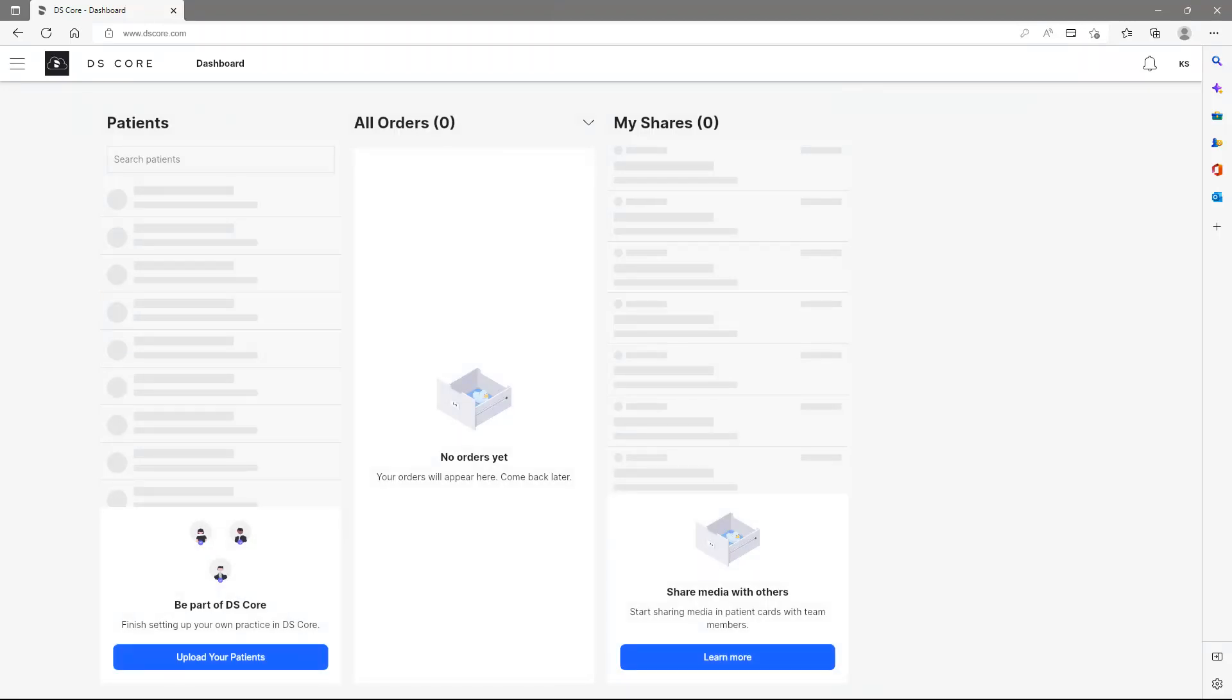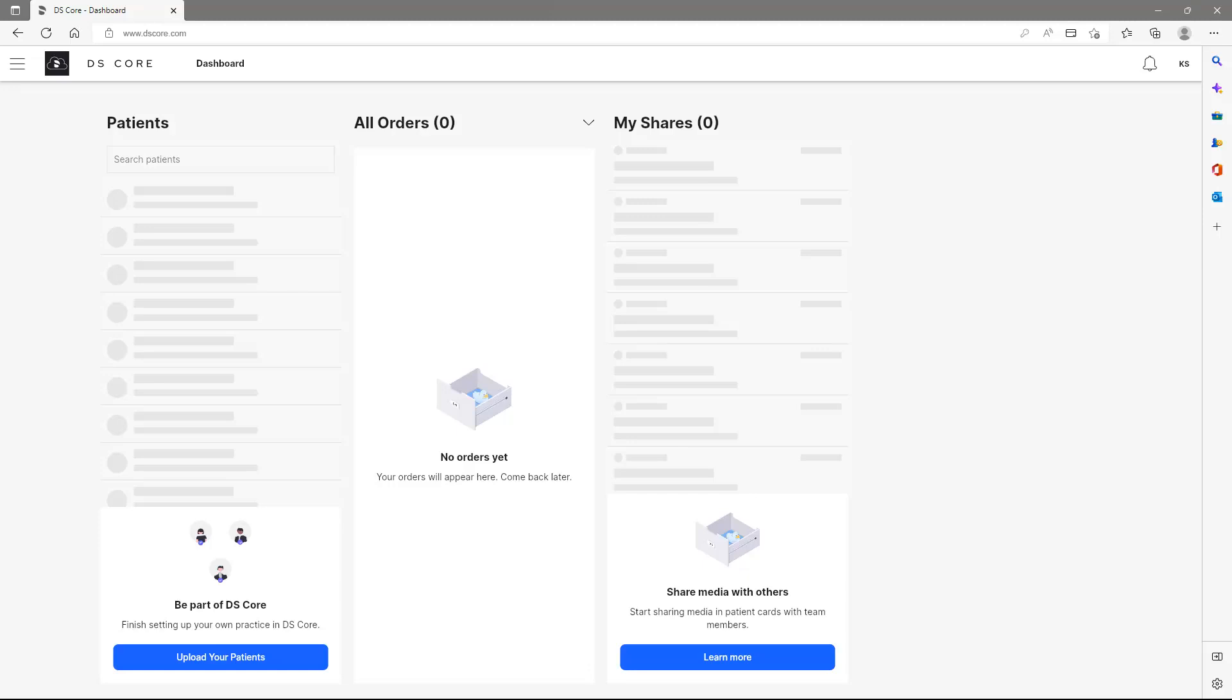To start building your patient media library, click Upload your Patients and follow the instructions. You can find more video tutorials on our YouTube channel that will guide you through the process of connecting your Dentsply Sirona devices and more.